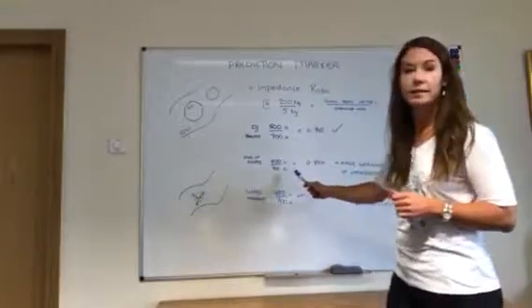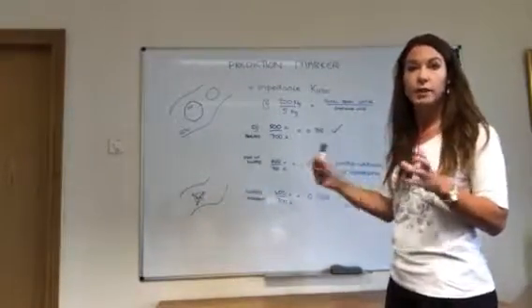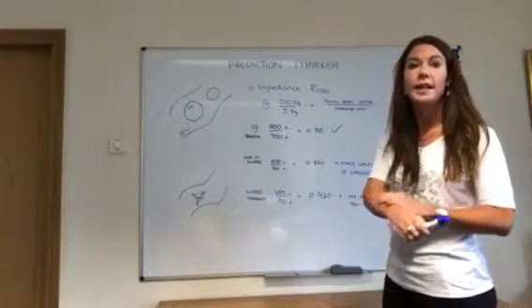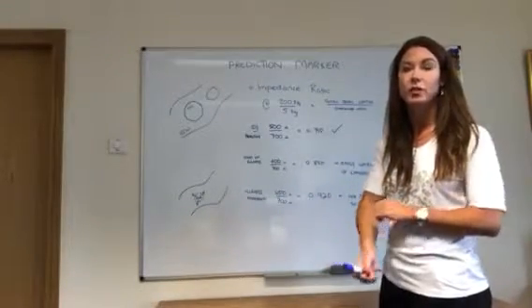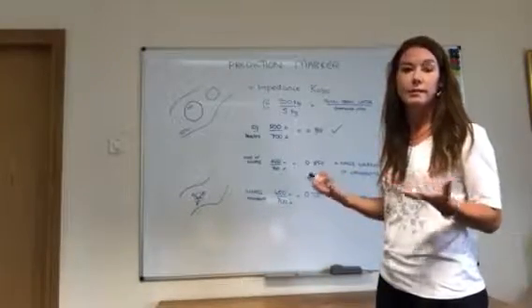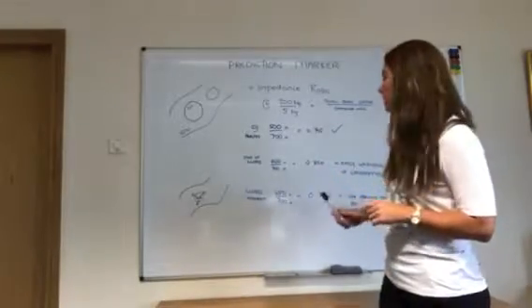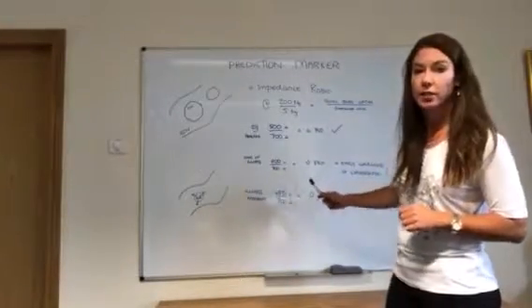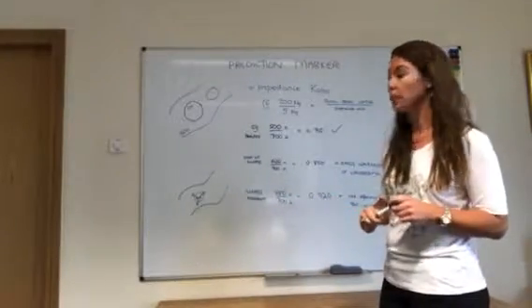That figure will show up before any signs of lymphedema are apparent in the physical manifestation of the body, before any pitting or edema is visibly seen. So it's a good indicator to monitor for patients who are likely to suffer from lymphedema.